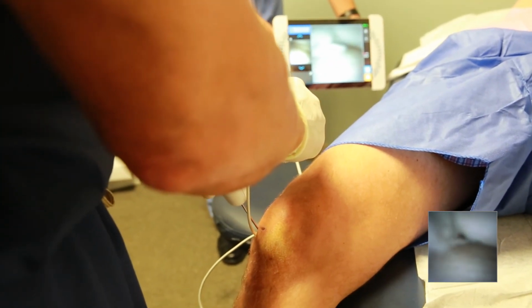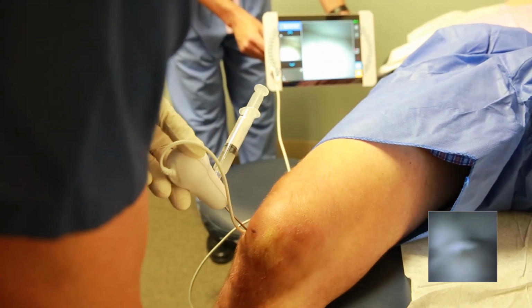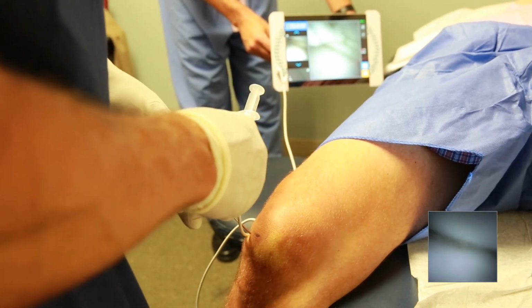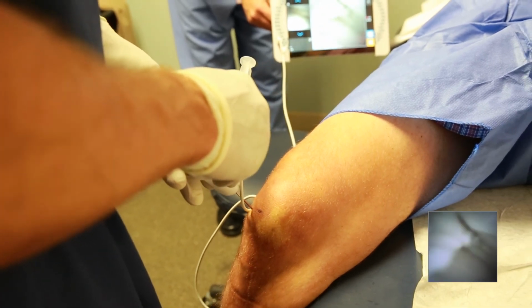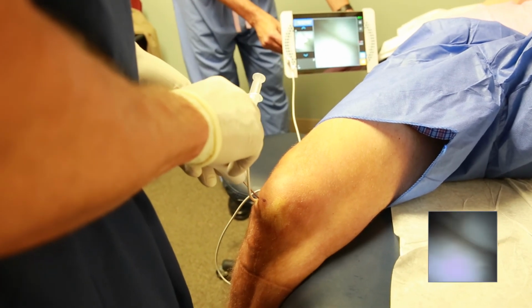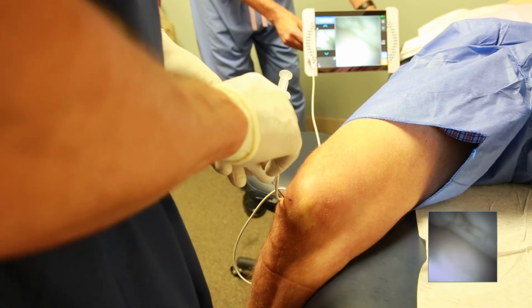I'm going to blow some water at it. So you're wearing out on that part of your knee. If we bend you more, you can check his whole femoral condyle, and you guys can see that cartilage defect. Now that's a big flap of cartilage, and we can get a nice picture of that. That's where my pain is. Well, that's where your catching is coming from. Your pain is from that. So you have the option of going in and debriding that.